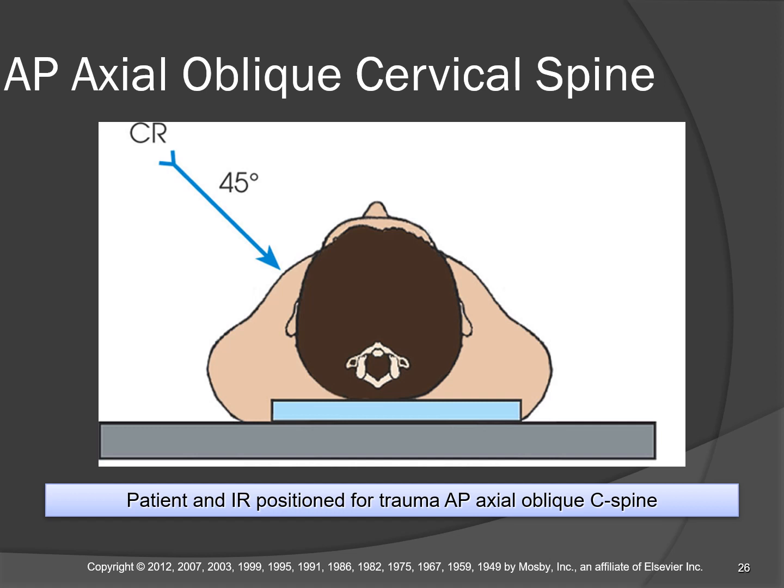The image receptor should be perpendicular to the central ray, but we can't make that work in this scenario. And so we just leave it horizontal. And what happens is we get transverse elongation of body parts. So the cervical vertebrae stretch out from left to right.